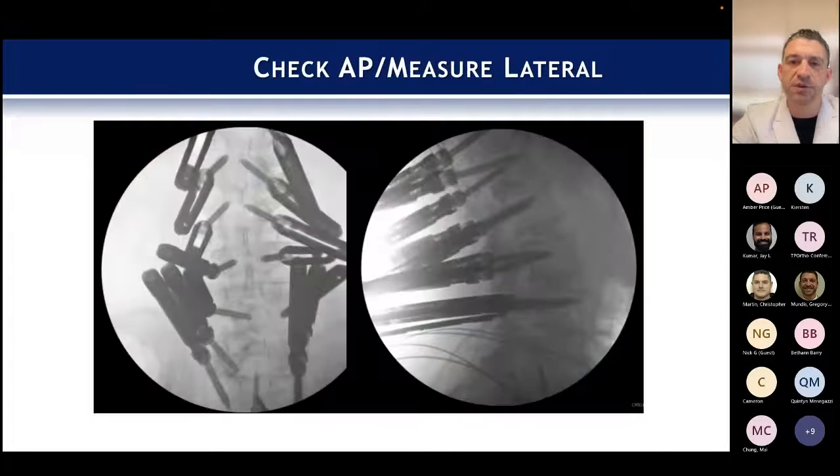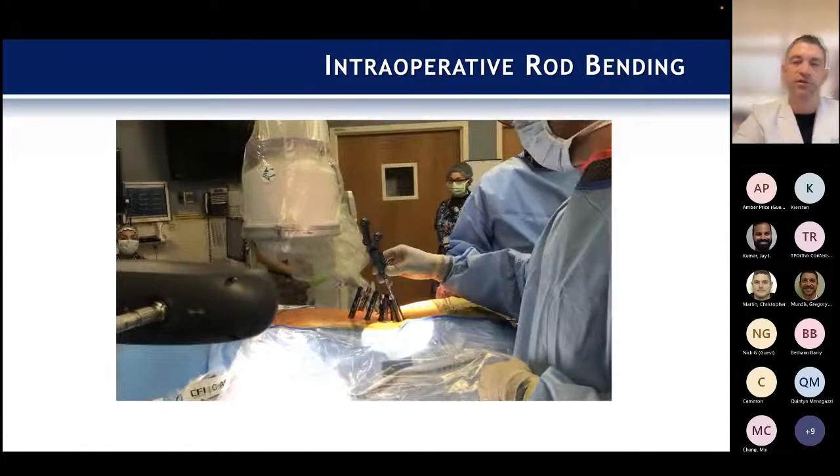The other thing is, obviously, at this point, just make sure you check your lateral for alignment that you like where you're at, because this is the only time that you really get to change it.